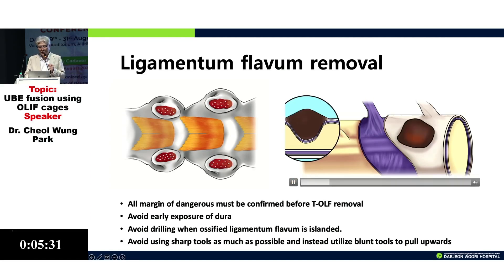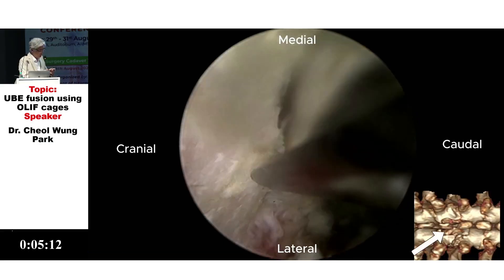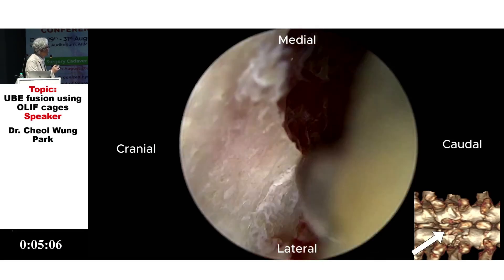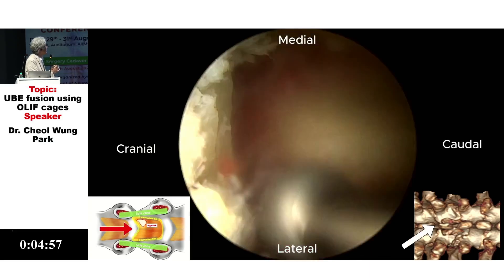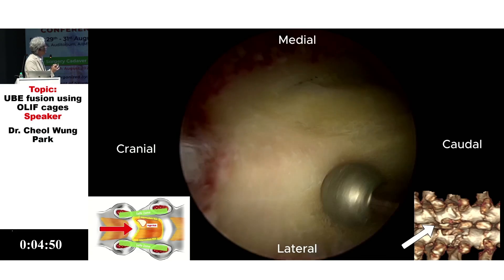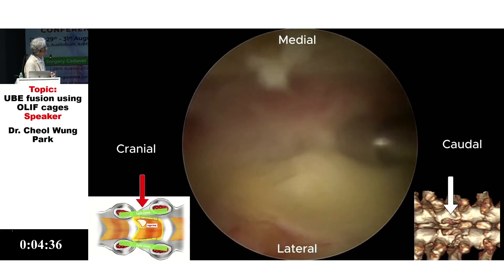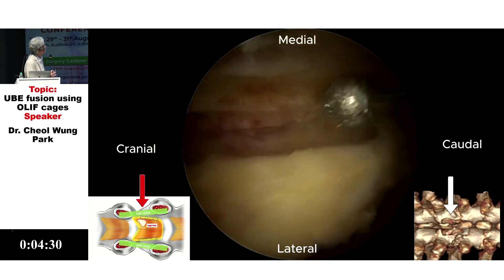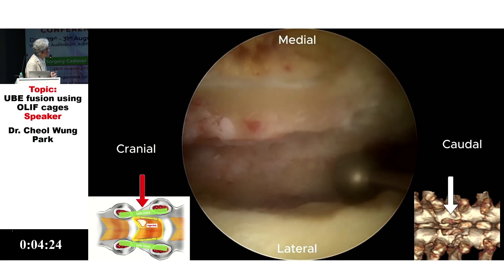Usually I start with spinous process release at the spinal laminal junctions, then outside superficial bone drilling and removal of medullary bone. Here is the cranial side with the exposed ligament, and I am drilling contralaterally using a matchstick drill for exposure of the contralateral SAP.